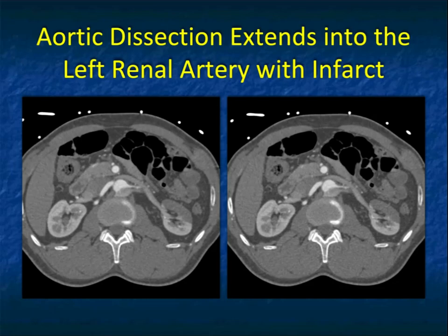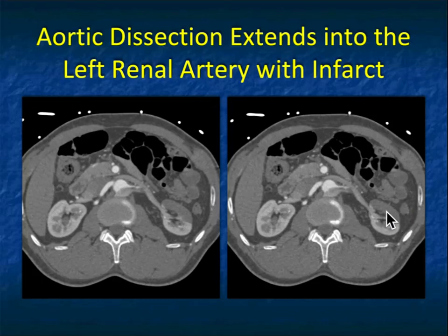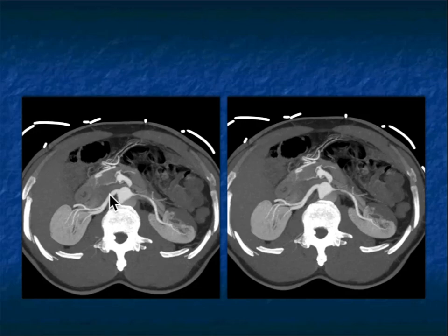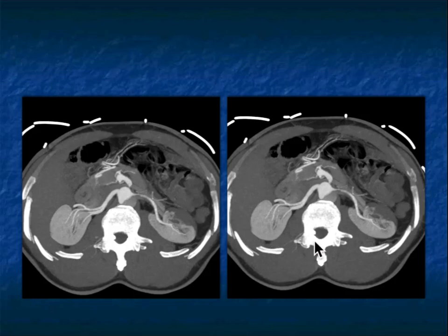Look at this case. The patient has a dissection of the abdominal aorta, and you can see the flap of the dissection is extending into the left renal artery. You can see the lack of perfusion — a developing infarct in the patient's left kidney. You can see it particularly nicely on the MIP imaging, where you really appreciate how narrow the vessel is and that some of the branches are cut off, which explains the developing infarct.